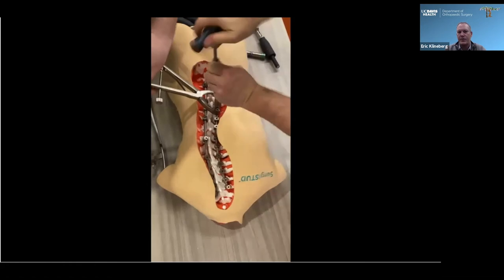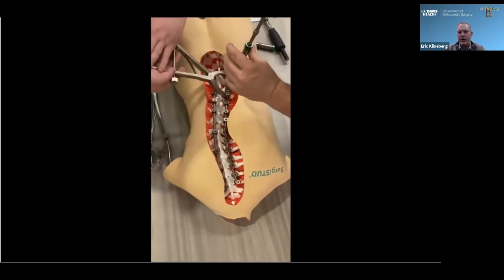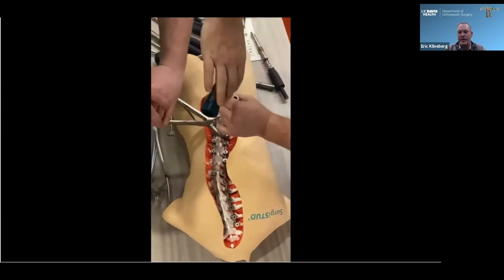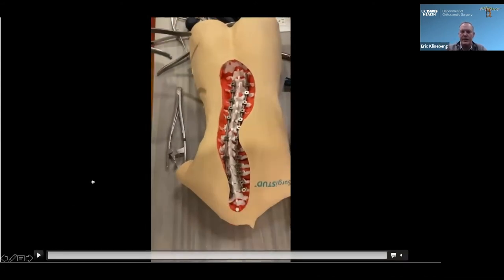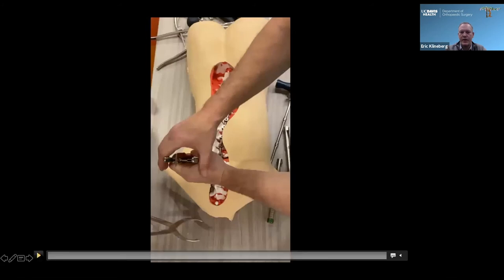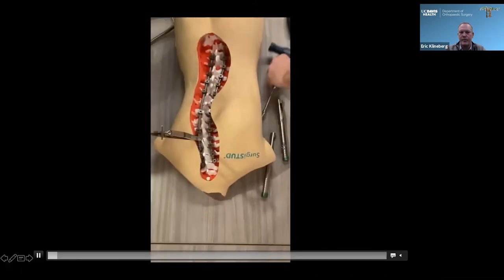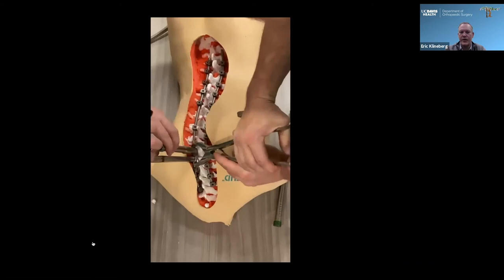So we've done it a couple times. You can just see the amount of derotation we do. And then I usually leave the very last segment until the very end, because that's the one I really try to spin back the most so that it gets things corrected. So that was the left rod, and now here's the right rod. And so this side is going to get shortened.